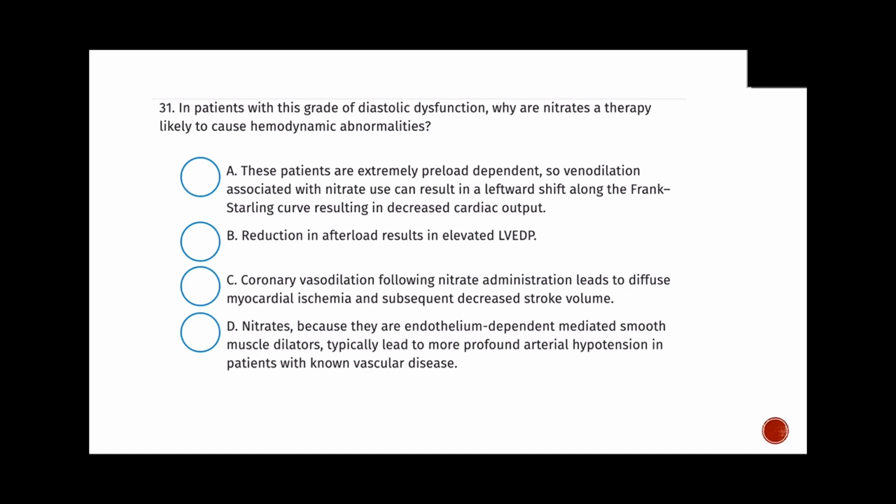I saw him as a consultation in the emergency department, and the question is, is this guy septic? Is he having a big new MI? So what happened is he was cardioverted to normal sinus rhythm, and all of a sudden had normal blood pressure after he had some washout of his nitrates. So this gentleman had advanced diastolic dysfunction in the setting of known prior coronary artery disease and ischemic cardiomyopathy. Then had new onset AFib and lost that atrial kick, that loss in preload with advanced diastolic dysfunction, and then took nitrates and had further decrease in his preload and subsequently got sicker.